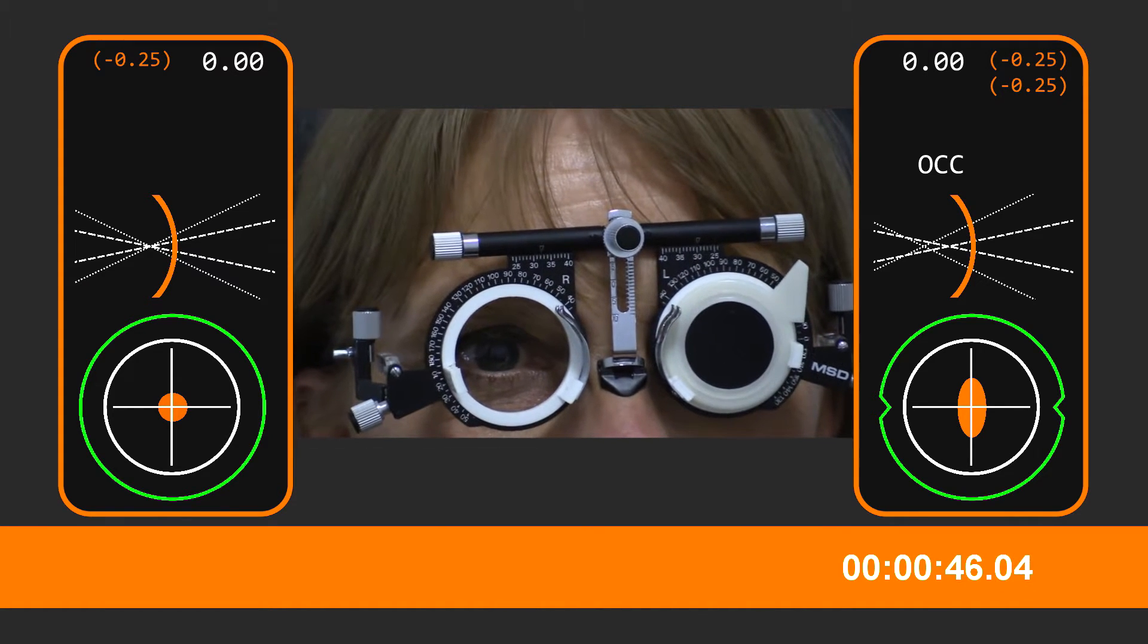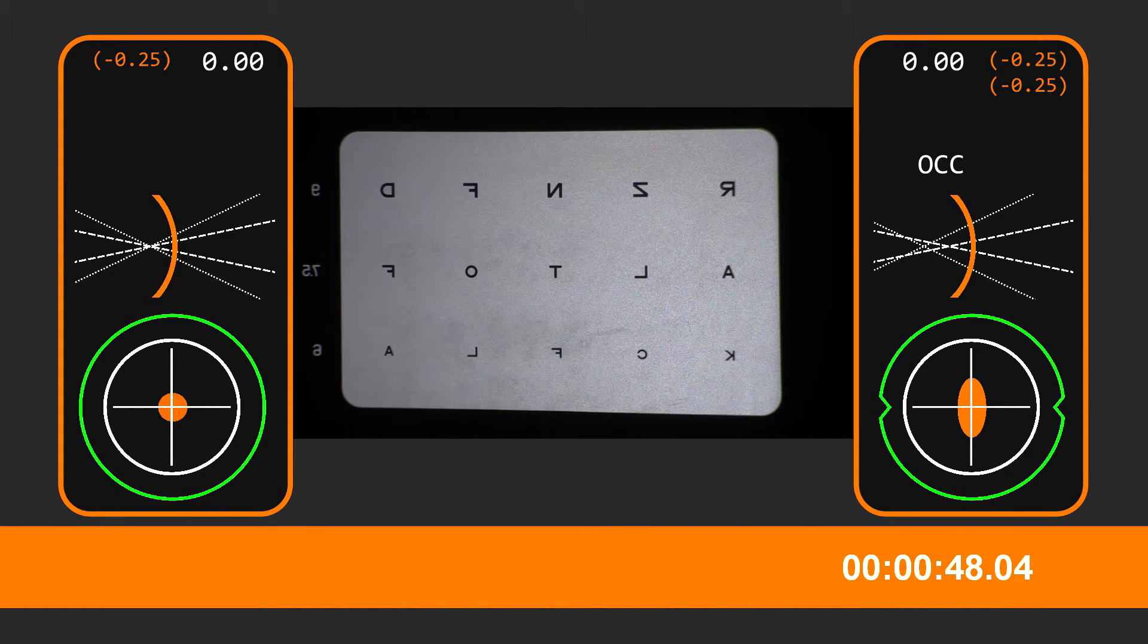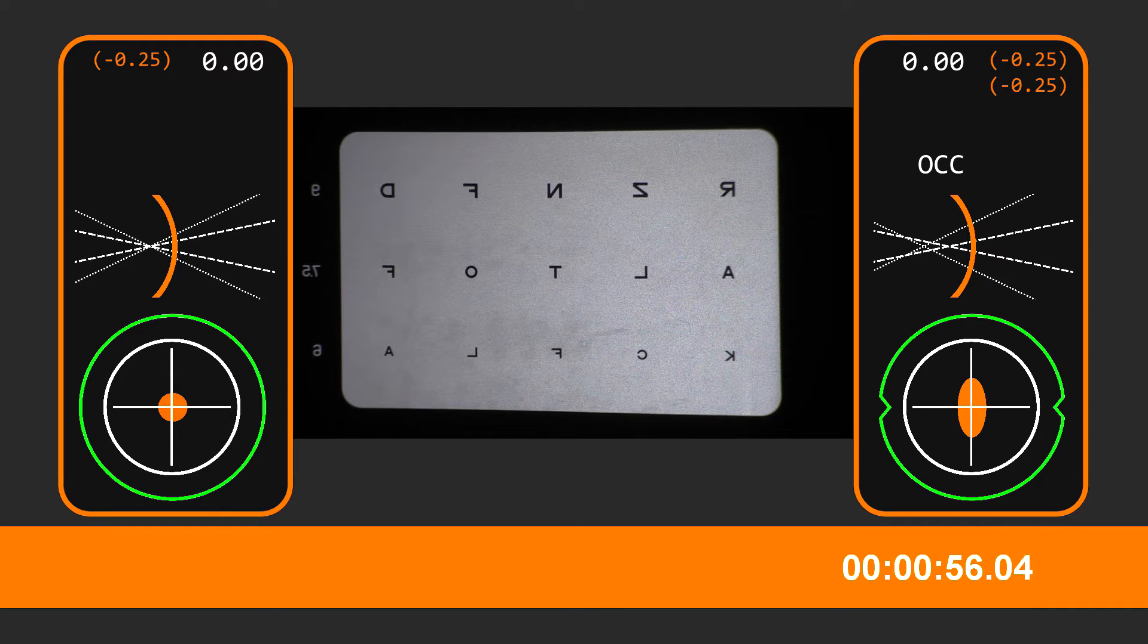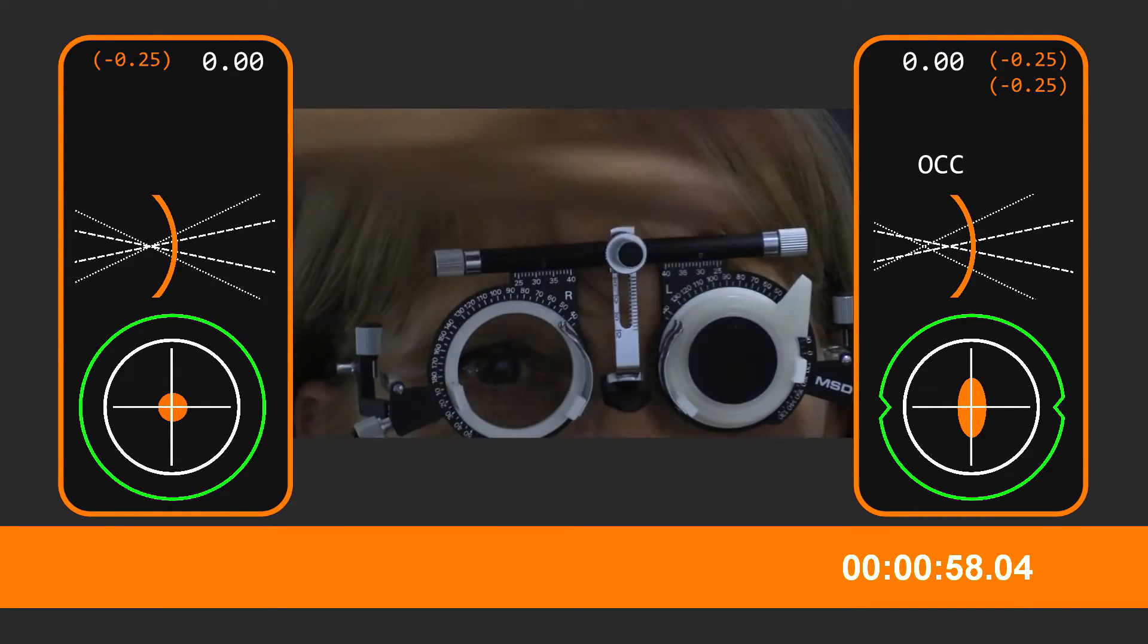So which one, how was the lowest one you can get? F, O, T. See, I'm doing it again. A, L, T, O, F. And I'm struggling with the bottom line. K, yeah, I mean, I can just about make it a bit of struggle. Oh, okay.